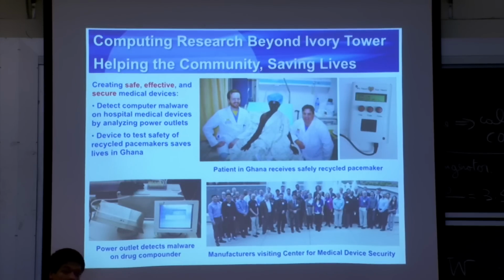And it replays these against the pacemaker leads. The pacemaker thinks it's connected to a patient, and then it responds. And so we check that response to see if it's actually diagnosing the cardiac arrhythmias and whether it's actually sending out the life-saving shocks properly. So they're now starting to test this through the whole sort of FDA process to get their blessing. And that's a work in progress. But it's called the My Heart, Your Heart program. You can go look it up if you're curious about it.